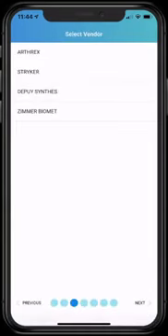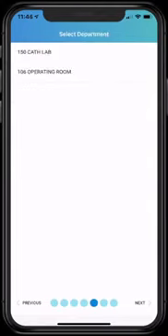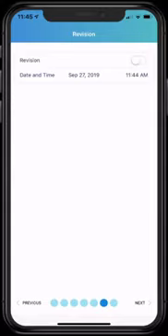Select the implant vendor, select the physician, and select the room we're in. It's a revision case, so we'll toggle revision.